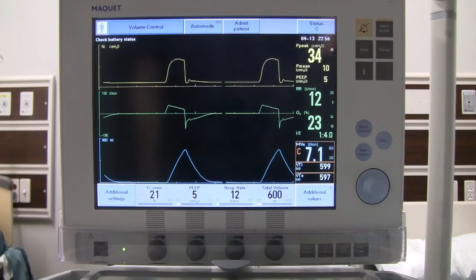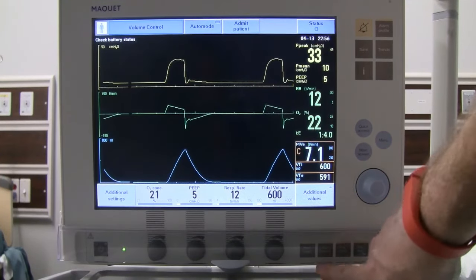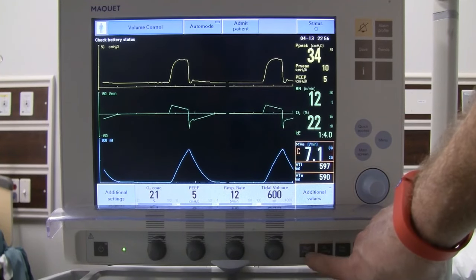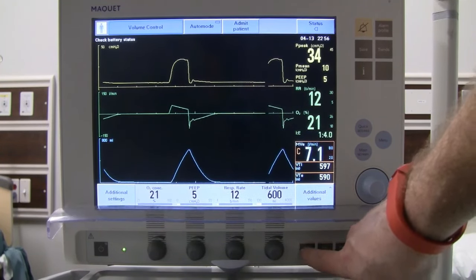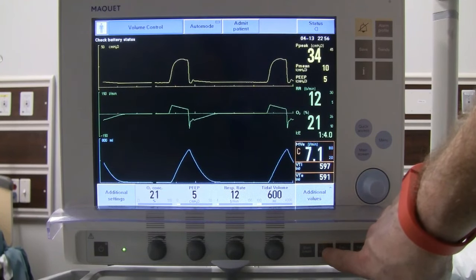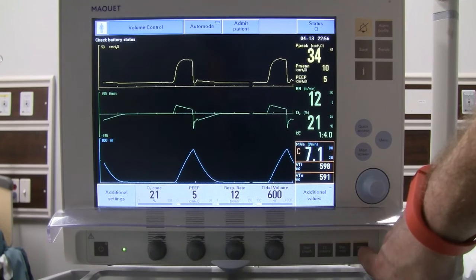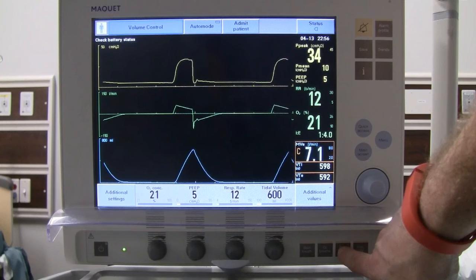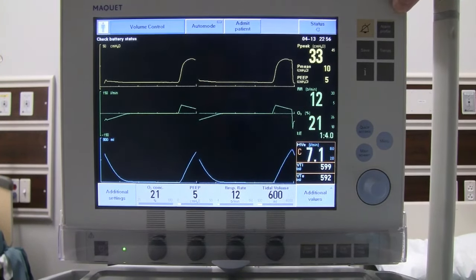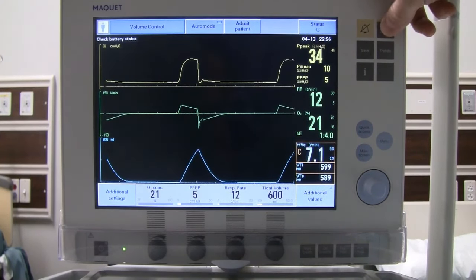Along with the fixed knobs we have a start breath button for delivering a manual breath, useful if the patient is in a spontaneous mode. We have O2 breaths for 100% oxygen or suction. We also have expiratory hold and inspiratory hold buttons for measuring intrinsic PEEP and plateau pressures.